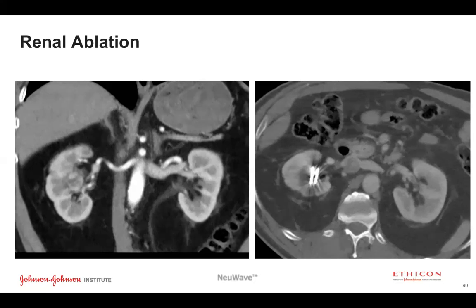If you haven't covered the lesion, it gives you an opportunity to take care of it right then and there. So that's the other real selling point to using contrast on the table, especially early in your experience, and especially if you have the ablation confirmation software, because it really helps you to decide if you have an adequate margin and if you are in a position to take care of something right then and there.